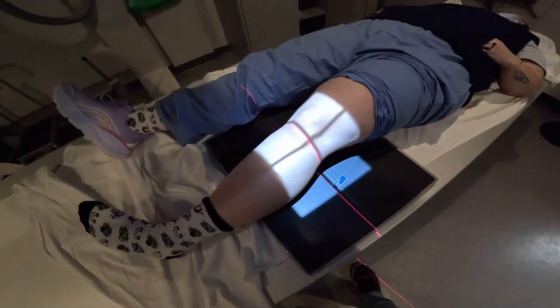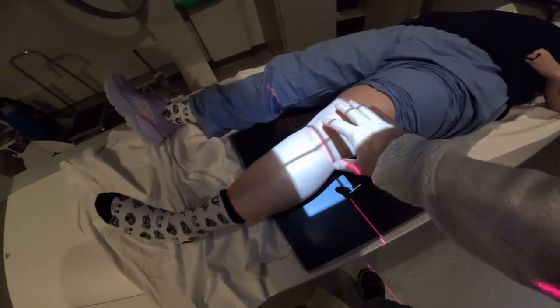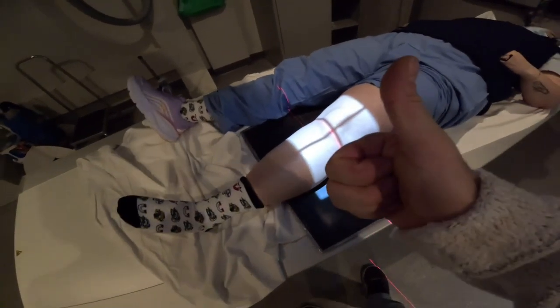So say a patient comes in and they're in way too much pain. They can't roll their leg in at all. It hurts when you try to roll them in. There's still a way we can get this done.